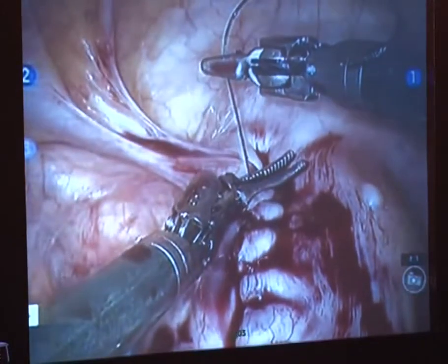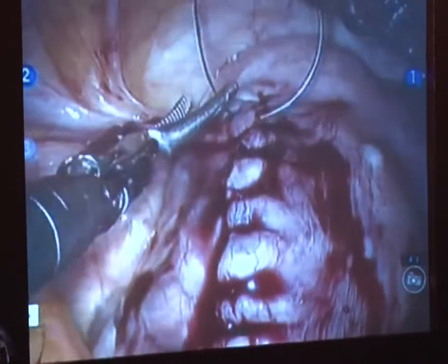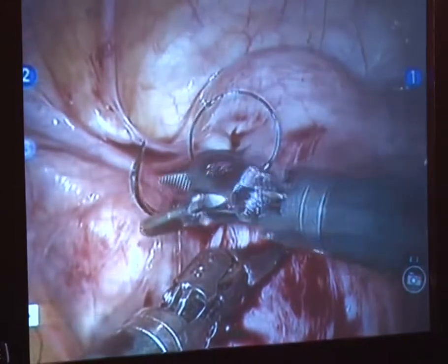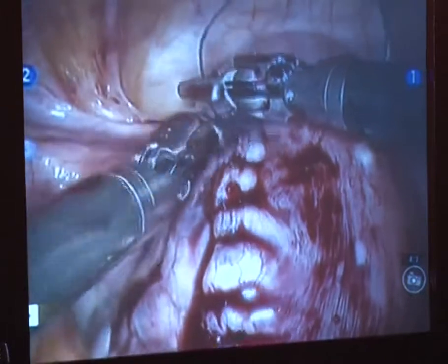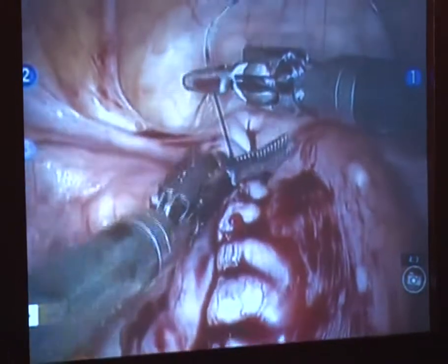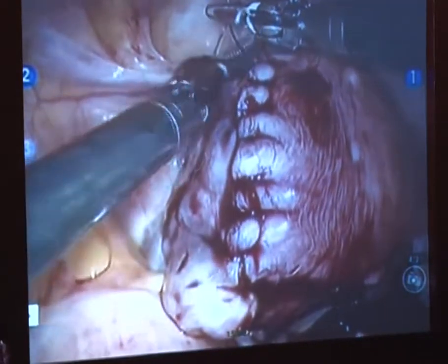I think that's a good point you bring up, that if you're not comfortable with running suture, don't use the suture cut. Otherwise, you're going to get frustrated and cut your suture by accident. Can somebody come in with a scissor and cut this right here, please? We've seen it happen too often at our place, so when we're running, it's always the mega without the suture cut. Sometimes we like to call the suture cut the suture gnaw, and sometimes it doesn't cut all that much. Cut it flush? Yep, right there. Perfect cut.